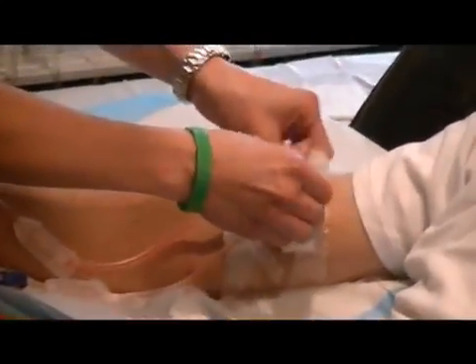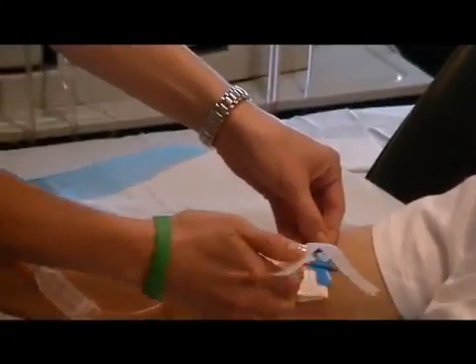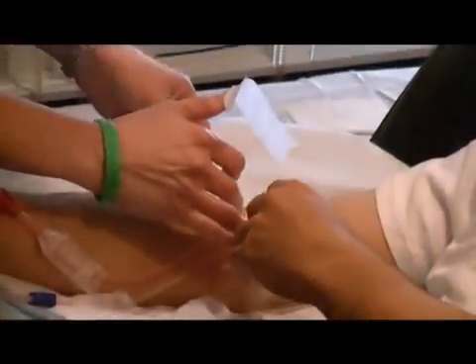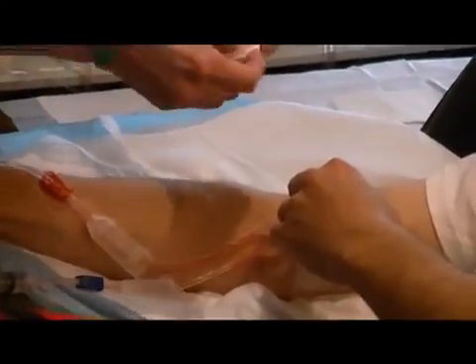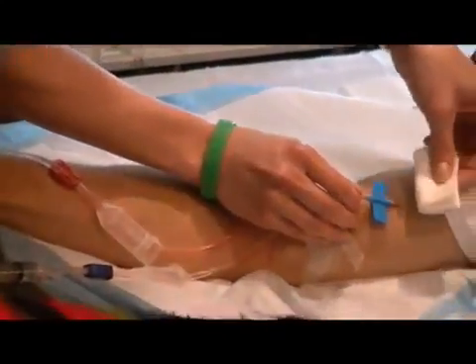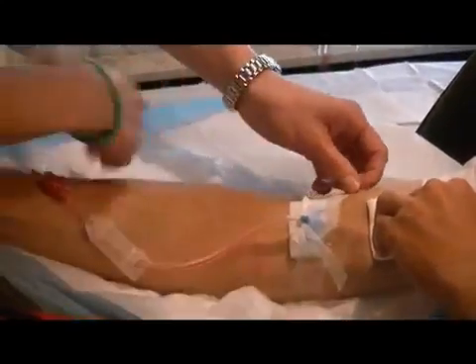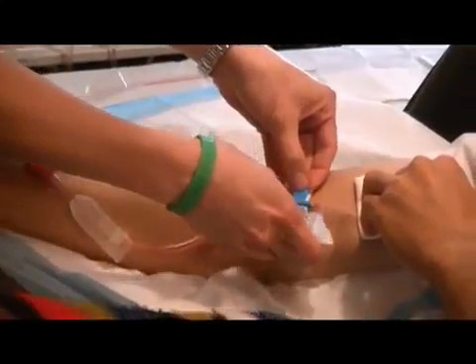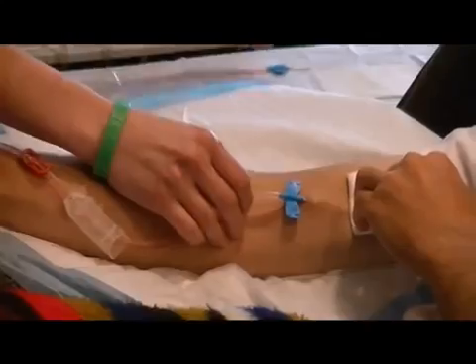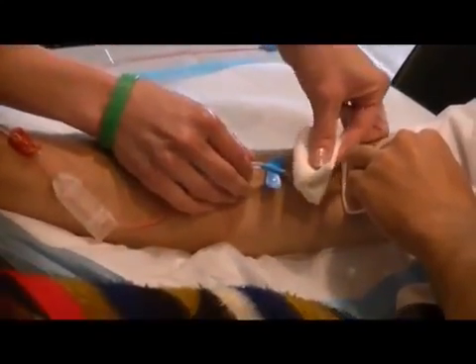And when we pull the needles out, he will hold pressure on them with the gauze for 5 minutes, and at the end of 5 minutes we check to make sure that the bleeding has stopped. His usually doesn't last longer than 5 minutes, so then we just pull it out, and once you get it out you put pressure on it and do the next one. He doesn't usually bleed too bad. We've only had a couple episodes where he took longer to clot. And we pull this one.